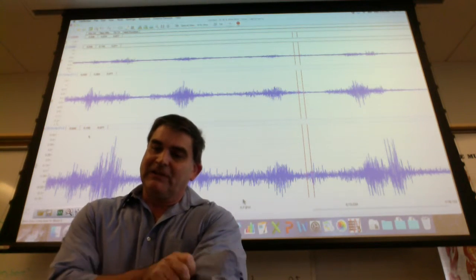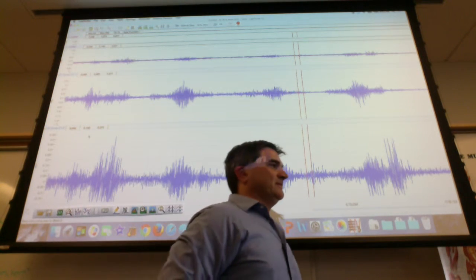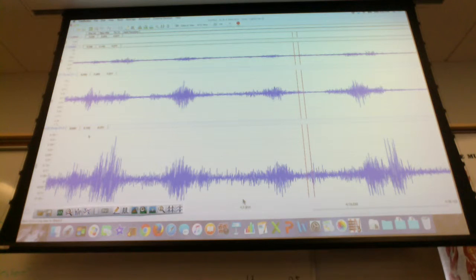Now, let's take a look at what happens to the activity of an antagonist when an agonist is active. So look at your agonist, and you can look at flexion. So let's go with flexion. What happens when the bicep is active during flexion? What was the average value we have here? Let's go around. What was your average value for biceps?